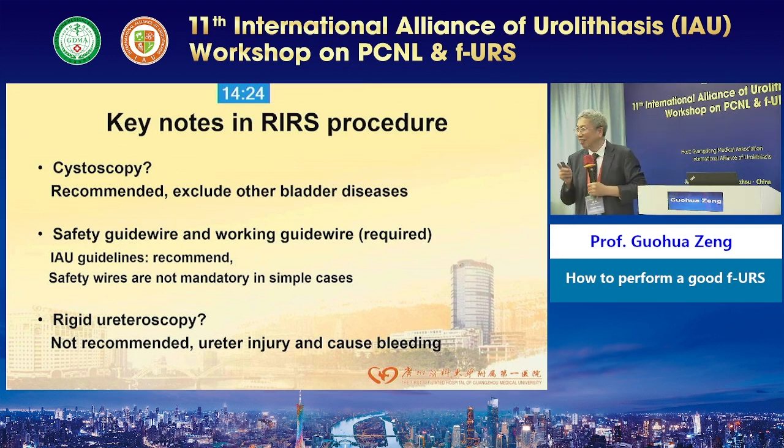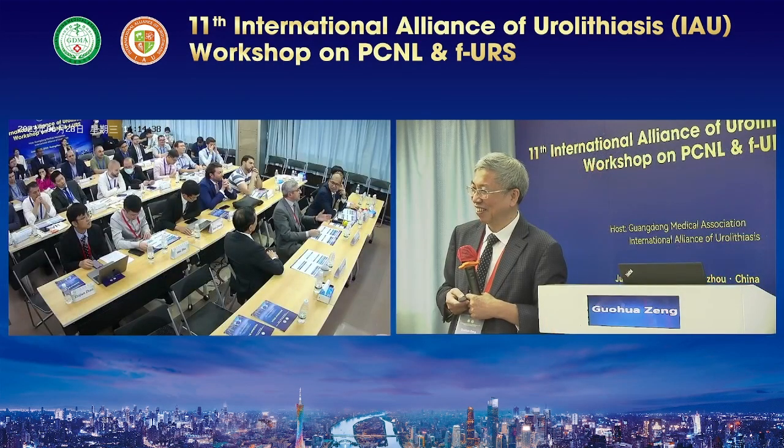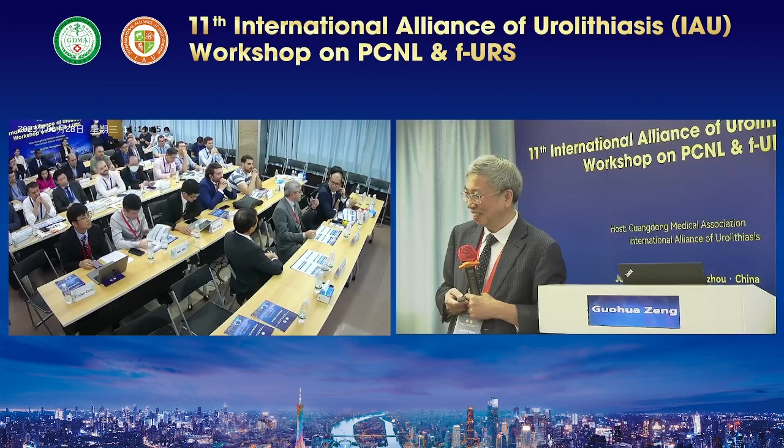And for a simple case, I think you can go without the safety guidewire. You must use it for all cases. I agree with you. Sometimes you talk to an expert, he said that in all cases, 2 guidewires. One, very simple case, there's no obstruction, you go up. Two guidewires for what? I'm asking, a safety wire for safe. Only one for me now.